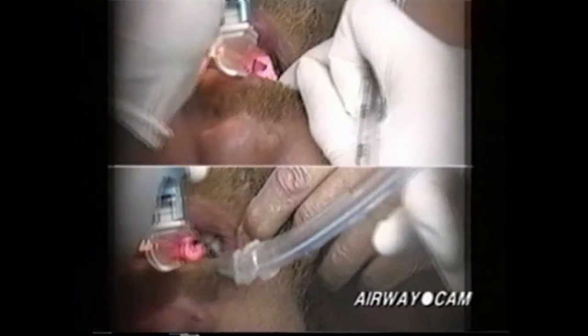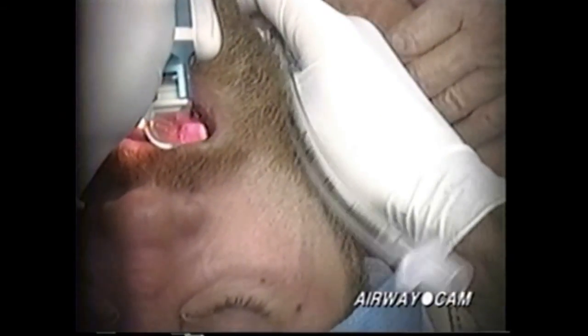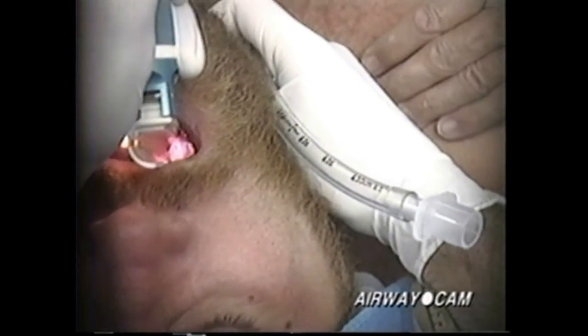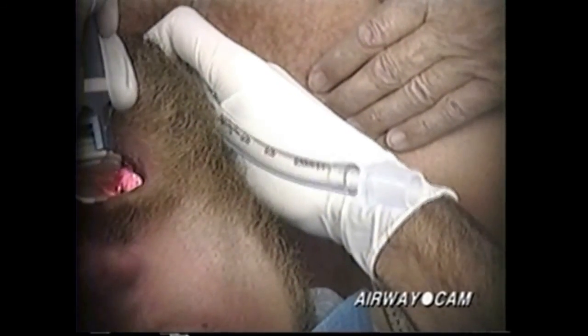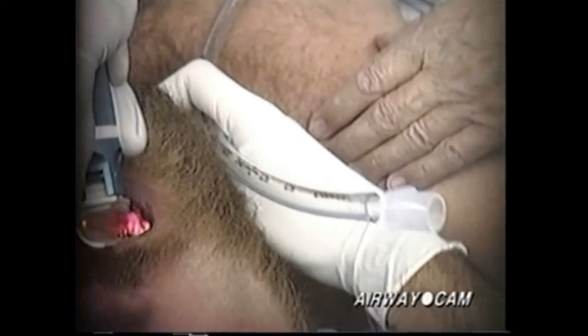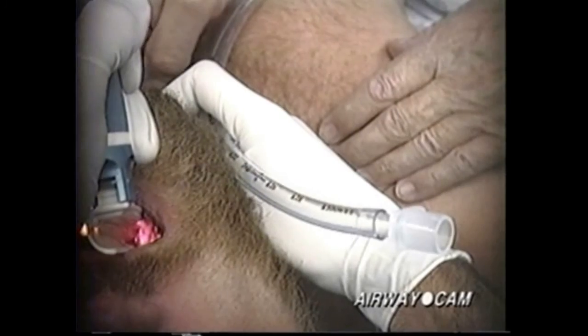In slow motion, let's take a repeat look at the use of laryngeal manipulation by pressing on the thyroid cartilage on the anterior neck. While pressure on the cricoid cartilage by an assistant is often used to prevent passive regurgitation of stomach contents, pressure on the thyroid cartilage aids landmark recognition and visualization.